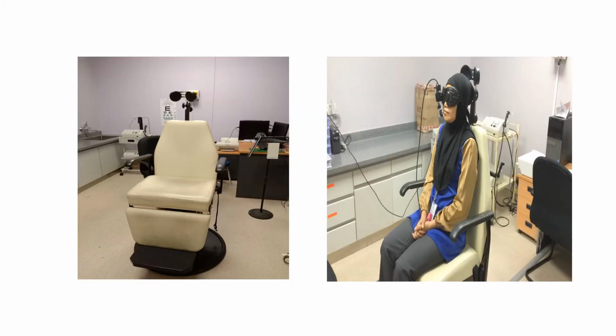This is a picture showing the chair which we use when conducting the VNG oculomotor test. So in my clinic setting, I use a similar chair to the one used to perform the rotating chair test. The patient will be instructed to sit on the chair with head upright, looking forward. Then we put on the goggles with infrared camera.